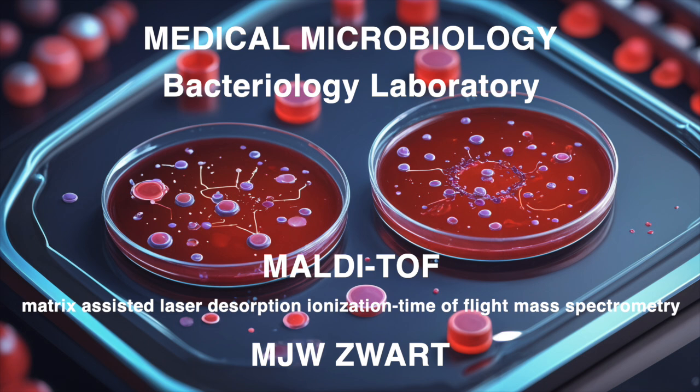Okay, question 2. Which of these is not a sample preparation method for the Microflex? A. Direct method. B. Extraction method. C. Dilution method. Or D. From Bactec bottles. I'm gonna say C, dilution method. I don't recall that one being mentioned. You are on a roll. Dilution is not a specific method outlined in the source.